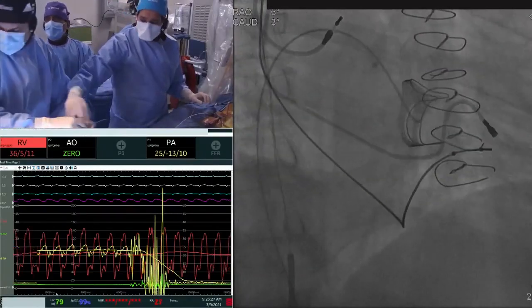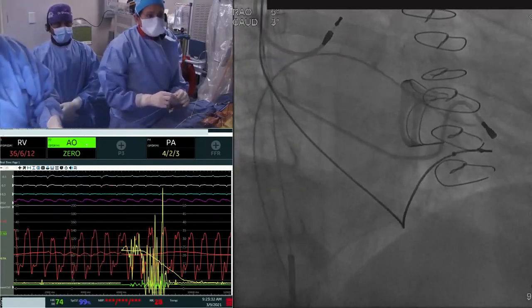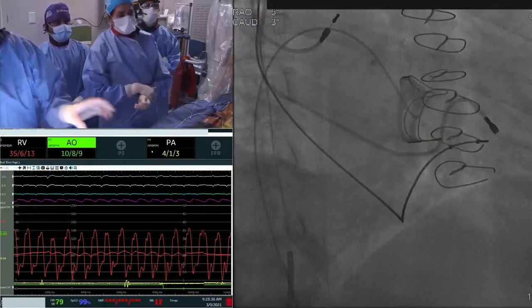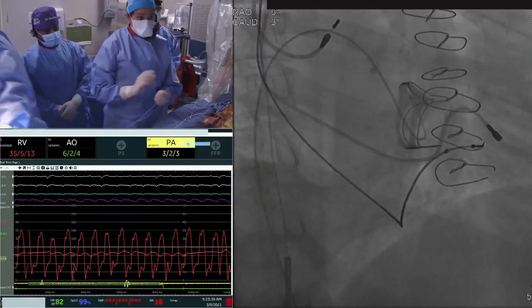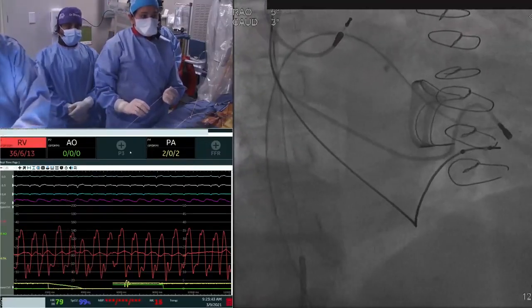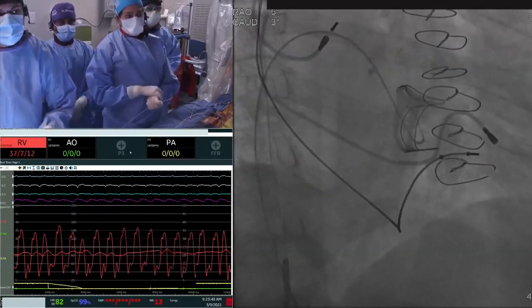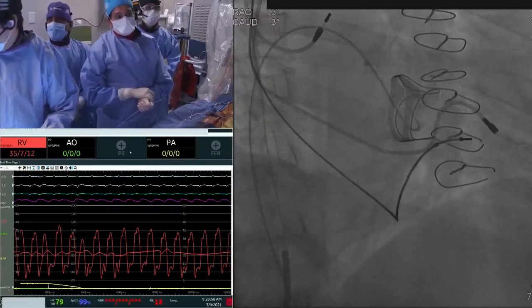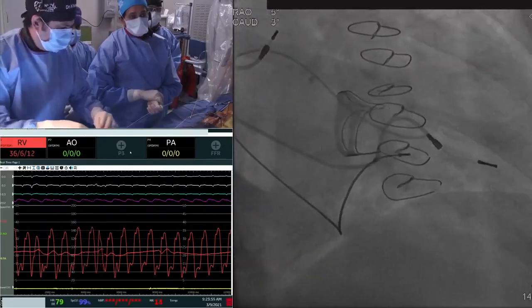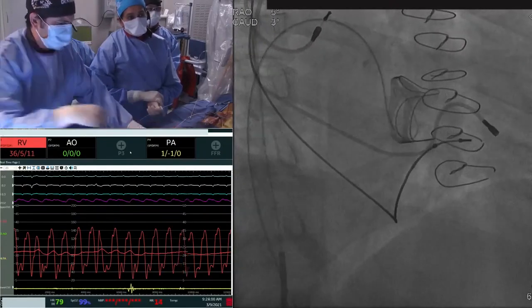Since it was a stenotic tricuspid valve, it was a little challenging to cross, but you can see how we have recorded that. How would you cross? Usually a pigtail, but initially the pigtail would not help us, so we had to go with the JR catheter, just with the J wire. Once you are there, you go to the RAO view like we have right here, and then you make sure you're in the center of the valve. That's how you see the steps, how I was getting in.